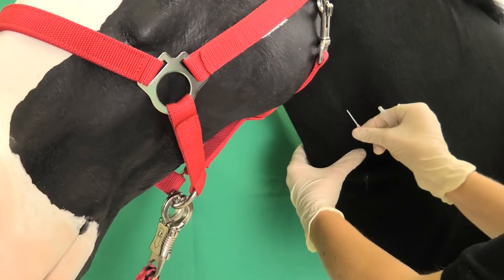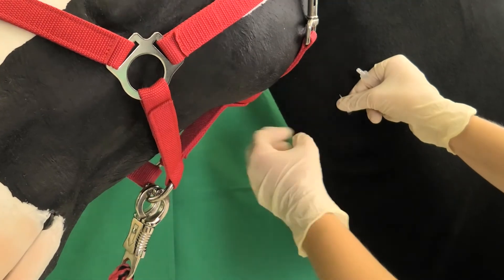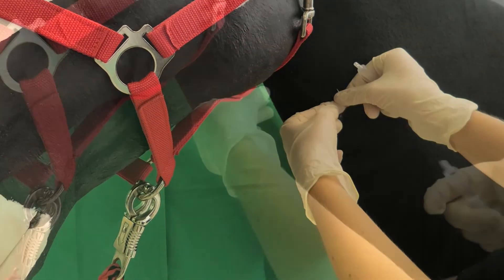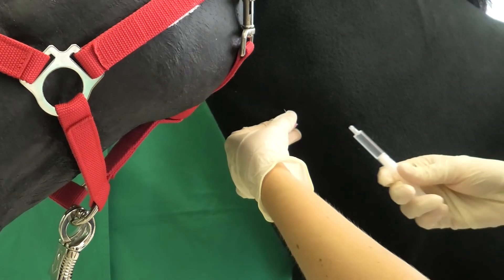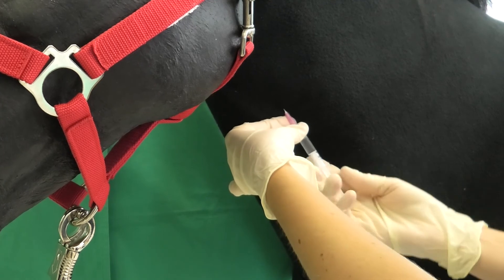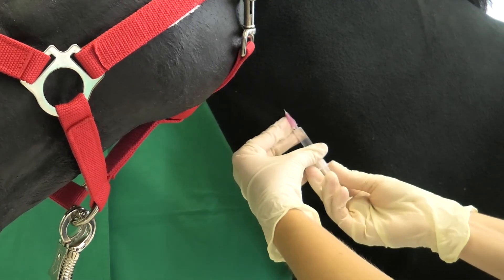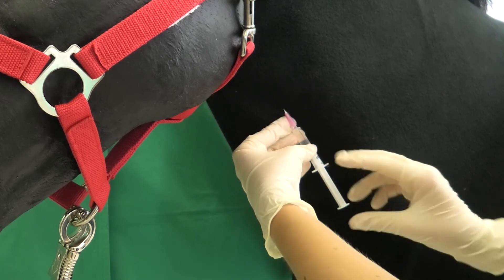The cannula is then advanced parallel to the course of the vein up till the cone. The left hand now takes hold of the cannula. The thumb and index finger hold the cone in place until the cannula is removed. The remaining fingers of the left hand can be used to block the vein below the cannula. The right hand can now attach the prepared syringe. Aspiration of a small amount of blood can be used to recheck that the cannula is properly seated in the vein.